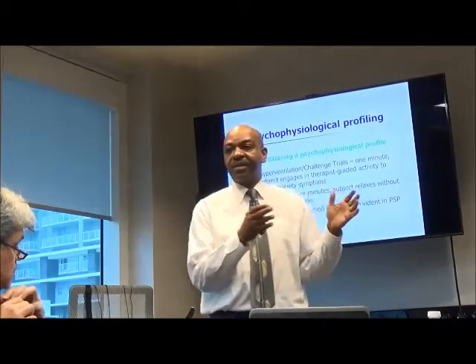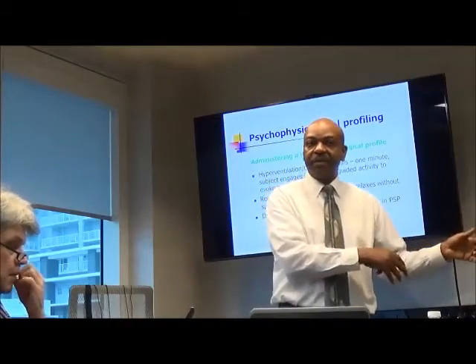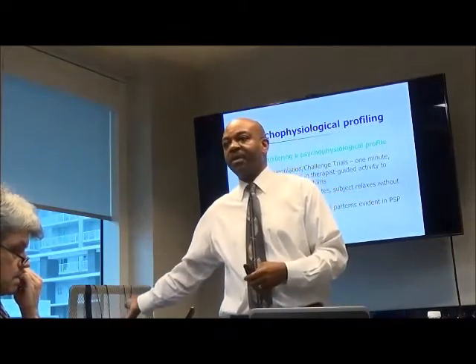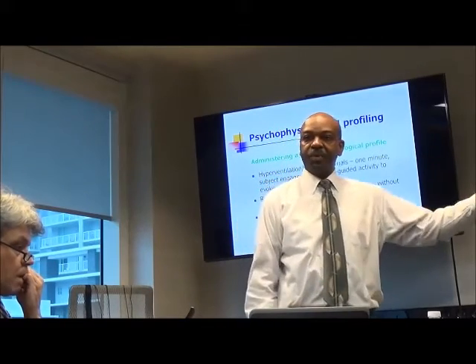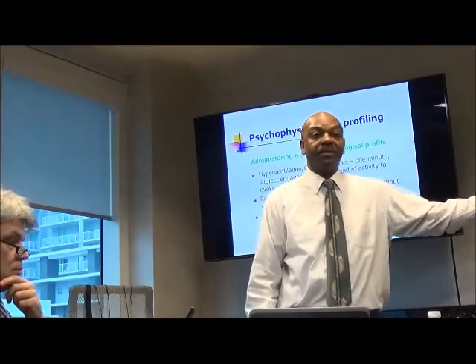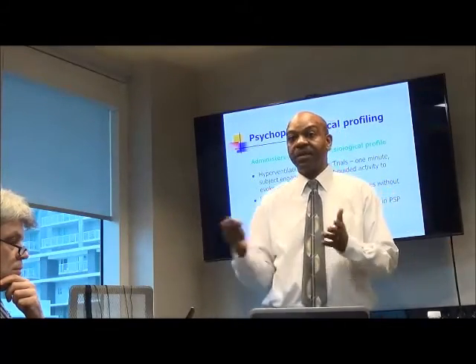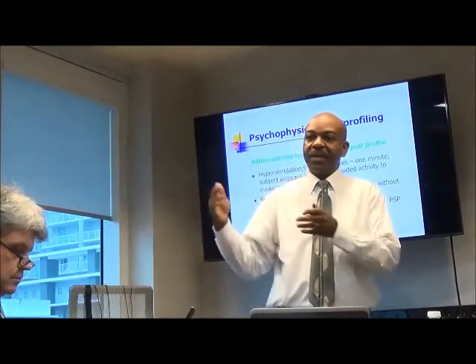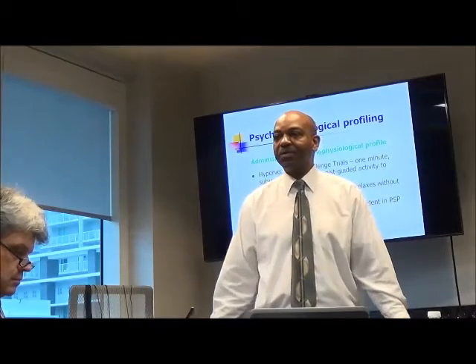And also it can serve as a before picture, so that later on when you're looking at their data, maybe they started out with a 77-degree temperature, and now you've been training with them, and their starting temperature is 90 degrees. And they can see that. Whereas if you just start right in doing training, they don't have that before picture, and they may say, well, I'm not any different than I was before.